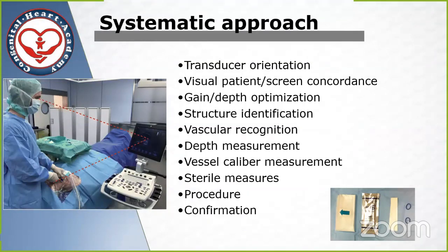I want to reinforce the idea that we have to always use sterile measures to access our vessels. And here in the screen, you see a properly performed procedure following all the sterile measures.